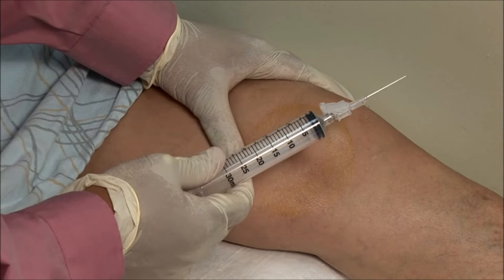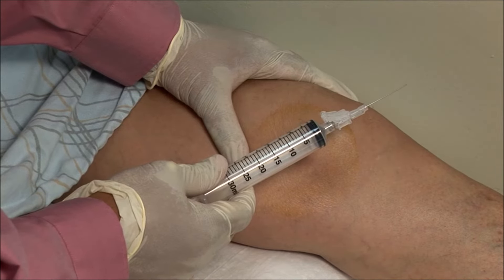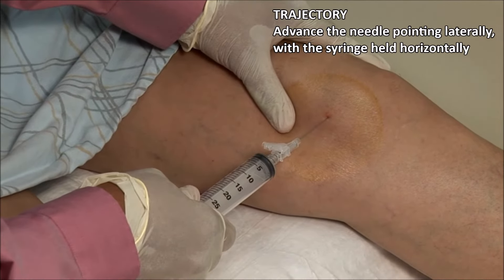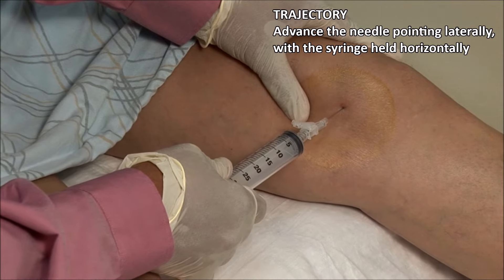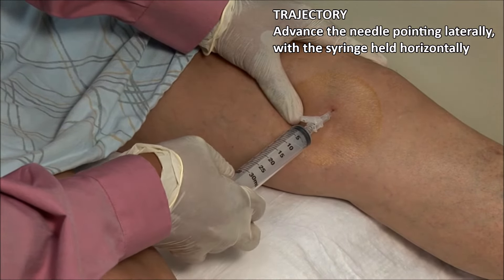Here I have a 30ml syringe with a 21 gauge 1.5 inch needle. I advance the needle aiming laterally with the syringe held horizontally. You will feel a give as the needle breaches the joint capsule.